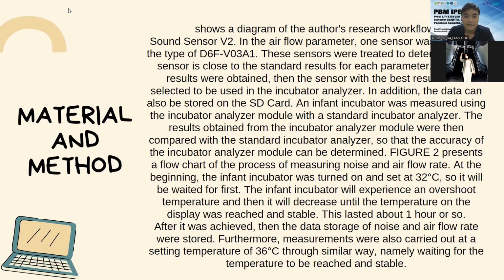At the beginning, the infant incubator was turned on and set at 32 degrees Celsius. The infant incubator will experience an overshoot in temperature, and then it will decrease until the temperature on the display is reached and stable. This lasts about 1 hour or so.